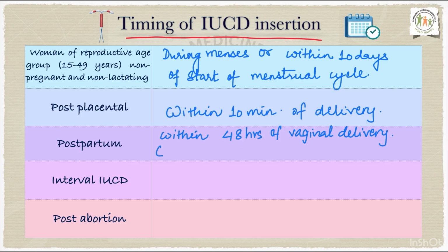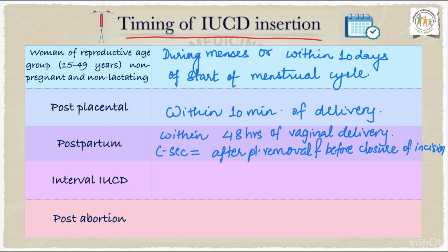During C-section, after placenta removal and before closure of incision, this is called intracaesarean insertion. Interval IUCD insertion is done any time 6 weeks after delivery.